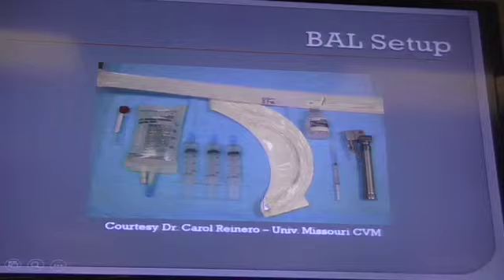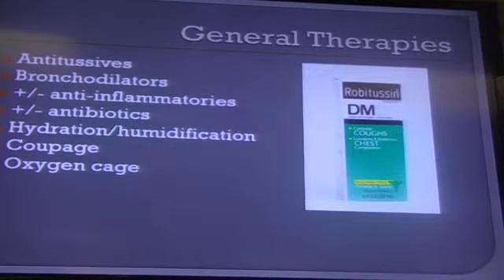So no matter how much fluid I flush down there, I can control their breathing. After we flush, we keep our patients on oxygen and do some positive pressure ventilation. The lungs are a perfect environment to suck up saline, because it's all just surface area. When the pulmonary crackles go away and their pulse ox comes back up to a normal level, that tells me, okay, we're done, and I can wake my patient up. So it can be done. Don't be afraid of airway washes.